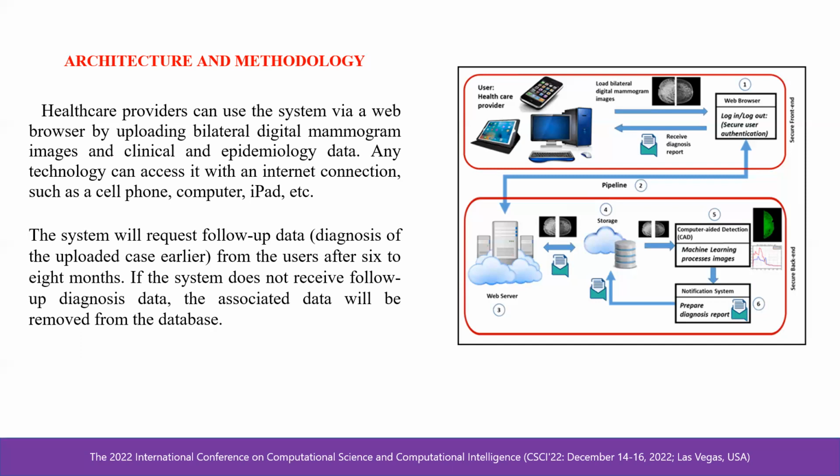The report will include the diagnostic decision, a chart and table showing the measured features and differences between the right and left breast, recommended referrals, and a figure showing the case placement for the IBC and non-IBC cancer clusters from the database.